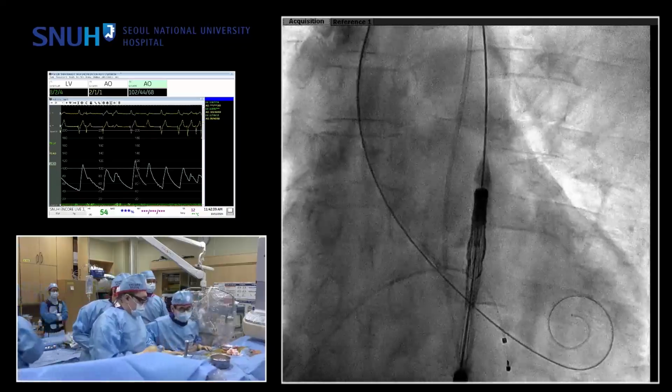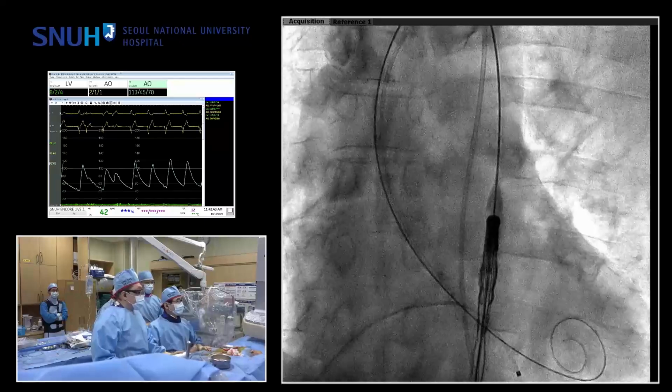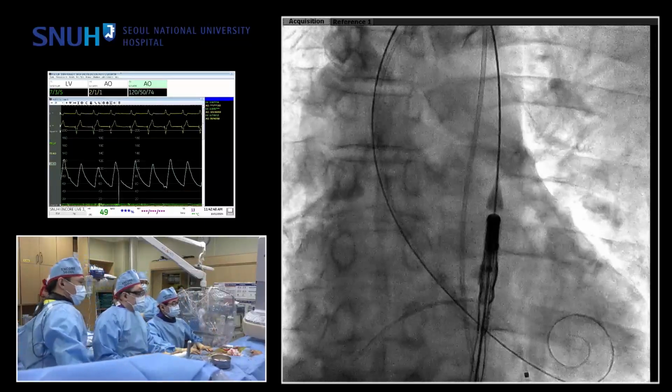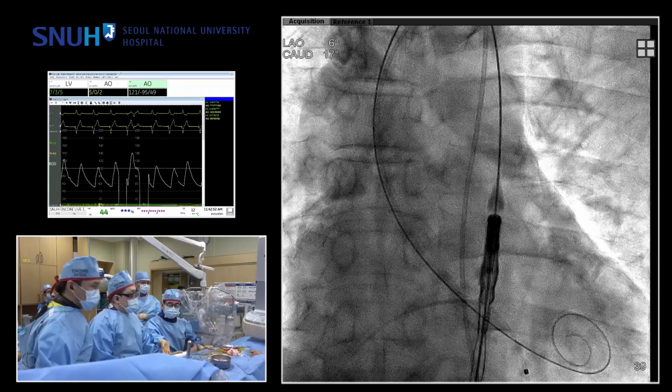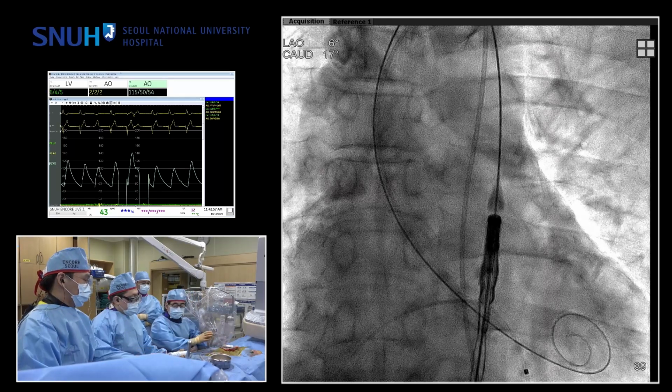So, best angle? Okay. Can you see the three-cusp? Okay, yes. The three-cusp adjustment is very good. Starting point is exit is 6 o'clock, but that usually changes.